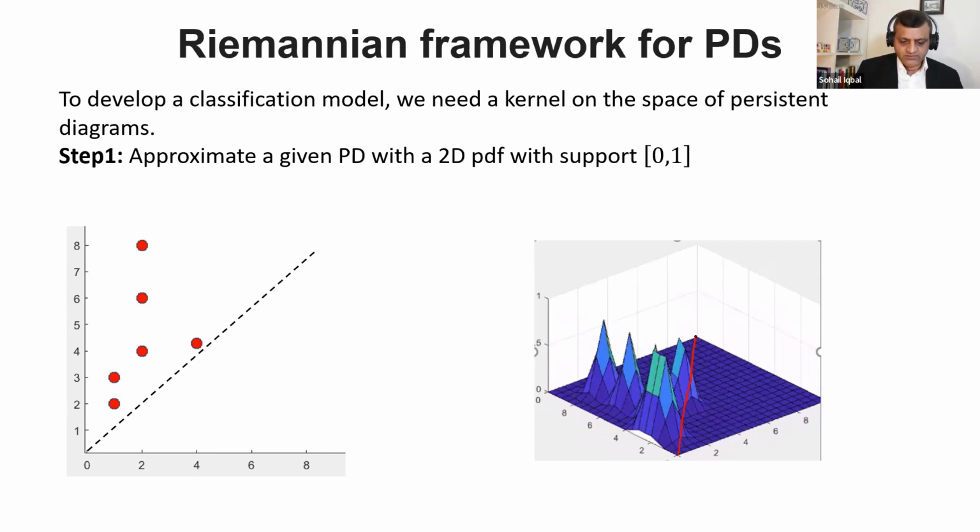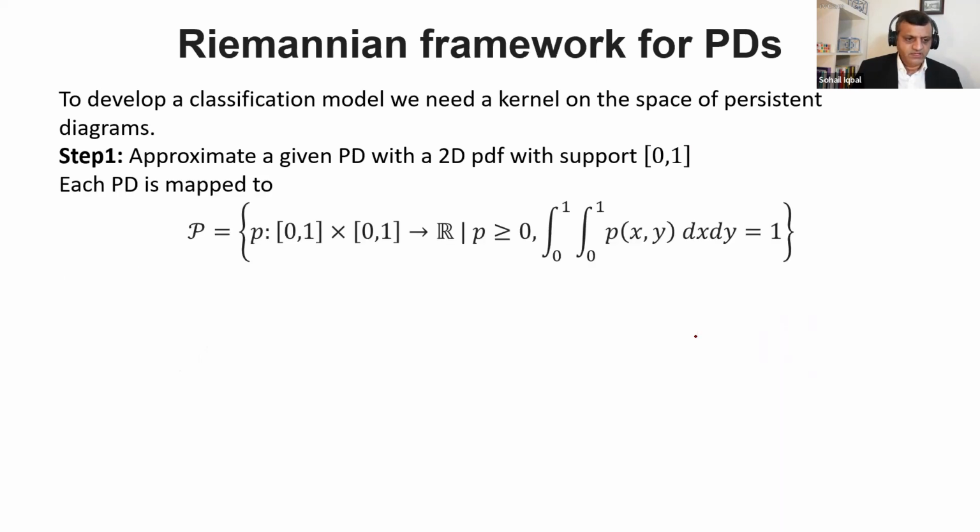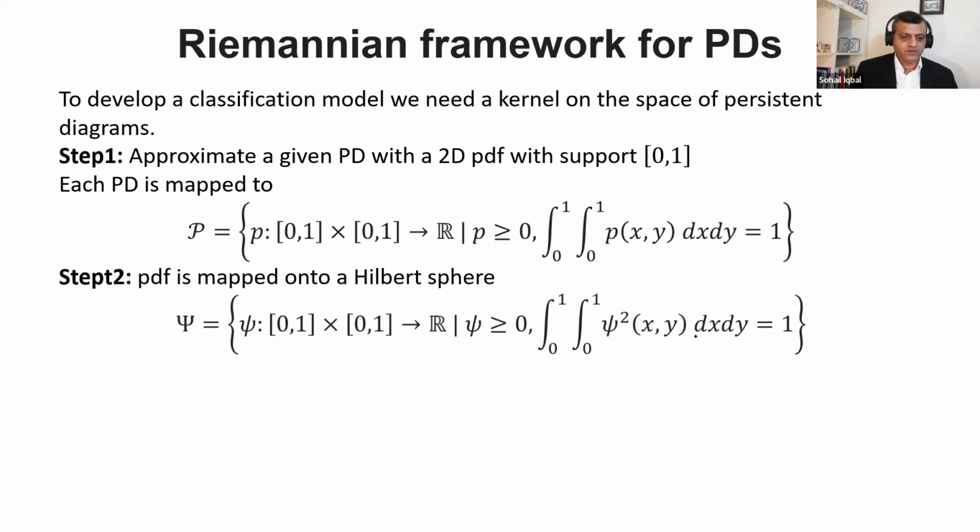But that's not really practical, because it's computationally very demanding, because the space we are in right now has the Fisher-Rao metric, and it's a very computationally demanding metric. The solution to this problem was initially used by Srivastava et al, and Sohail Anirudh et al used it in their study. The solution is to work in a square root framework. As you can see, there is a square root over here. So we are in a square root framework.